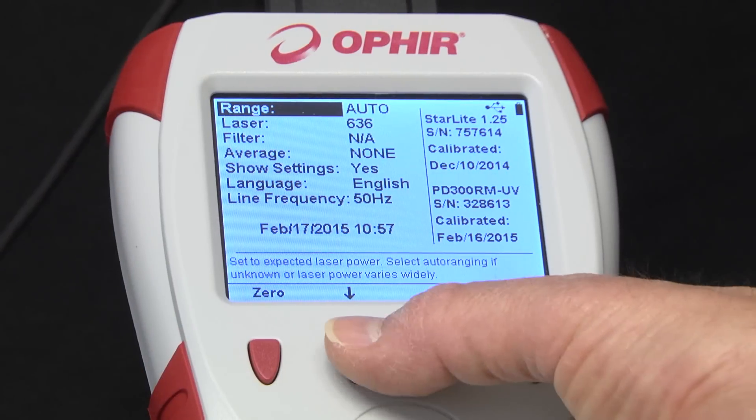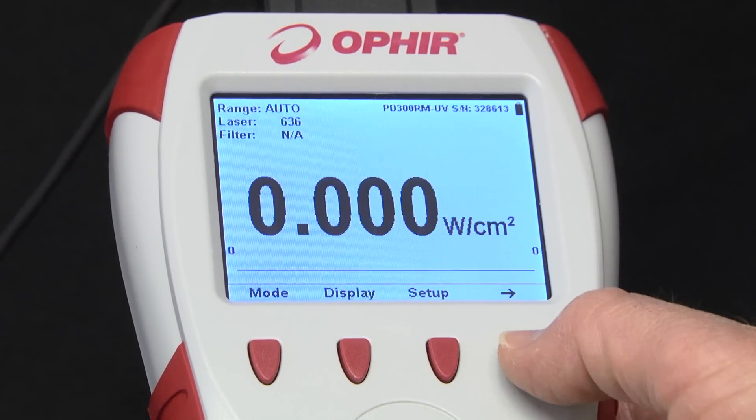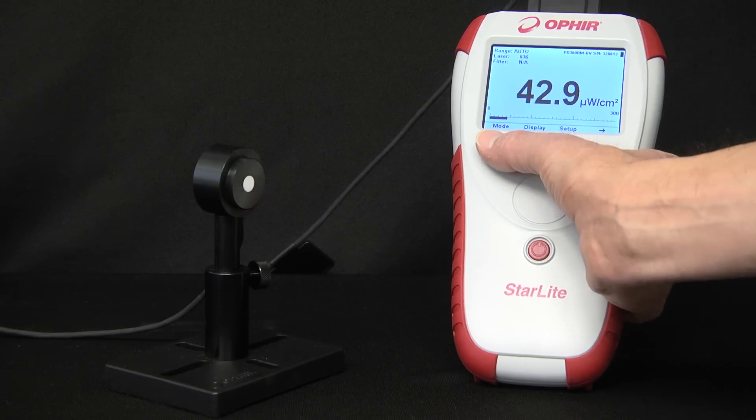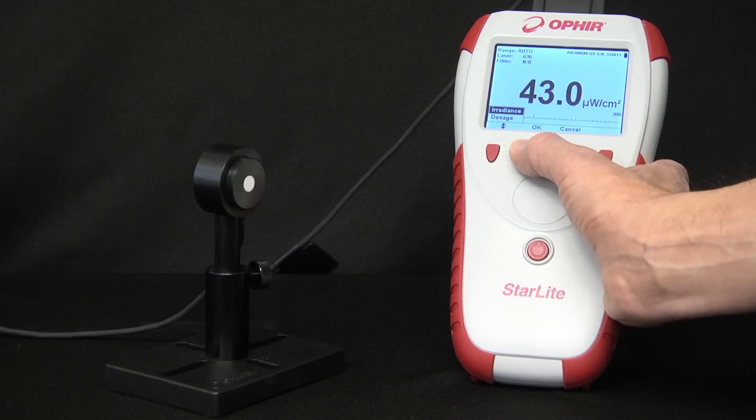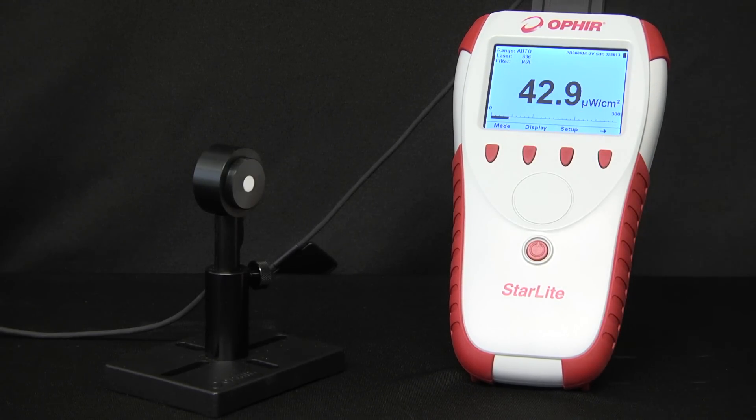We enter the wavelength of the light being measured. There are two modes of operation. In irradiance mode, the instrument displays a reading of irradiance in watts per square centimeter.